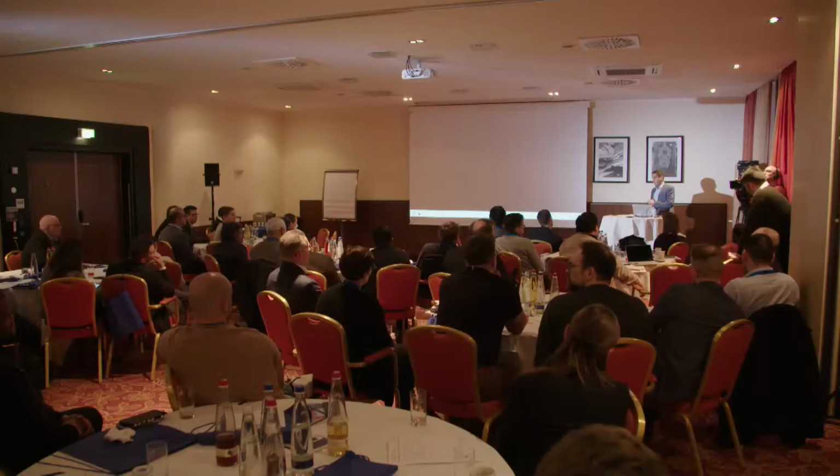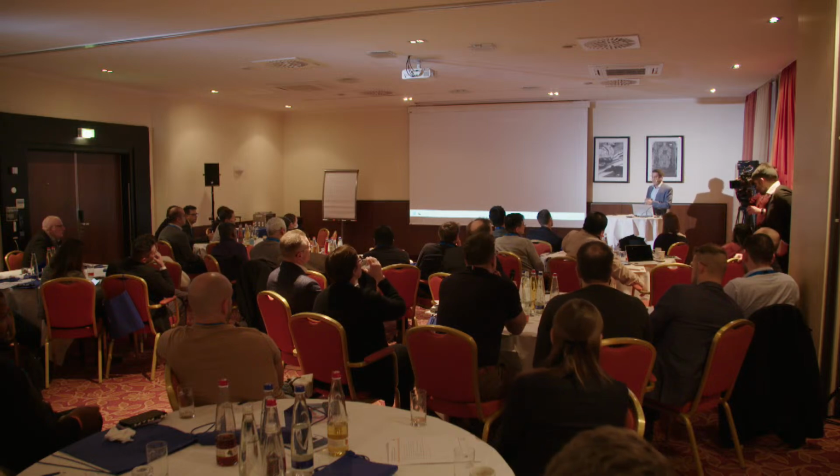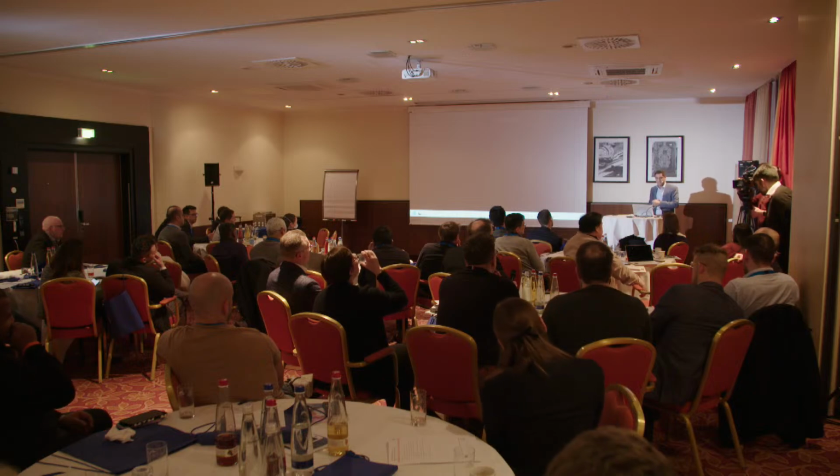But apart from that, I've got to say for below the groin cases, I'm a bit more than Mark and NT. I'm sort of 75% IVUS. I'd say for iliac cases, I hardly ever, if not ever, use IVUS.